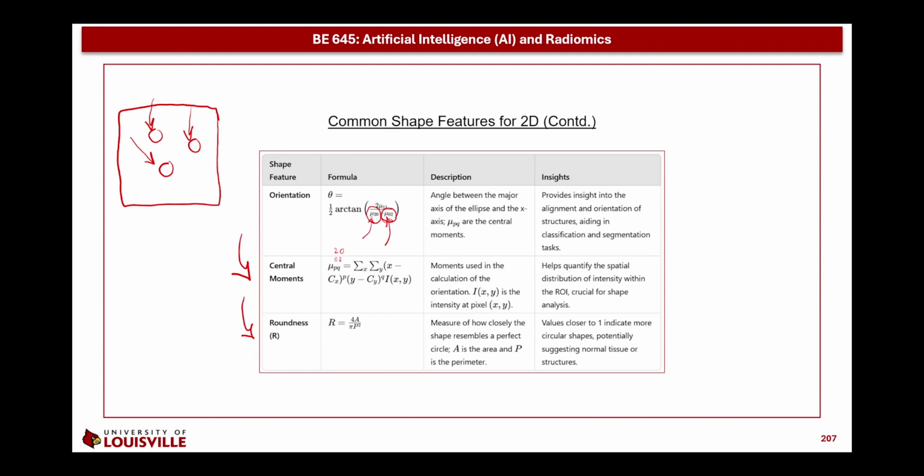If all of the dataset contains 3 ROIs, which is not a usual case, we can set the features to be split into 3 regions. The first region will be for the first ROI, the second for the second ROI, and the third for the third ROI, and finally we add the class here, so we get a file that we apply to the classification process.